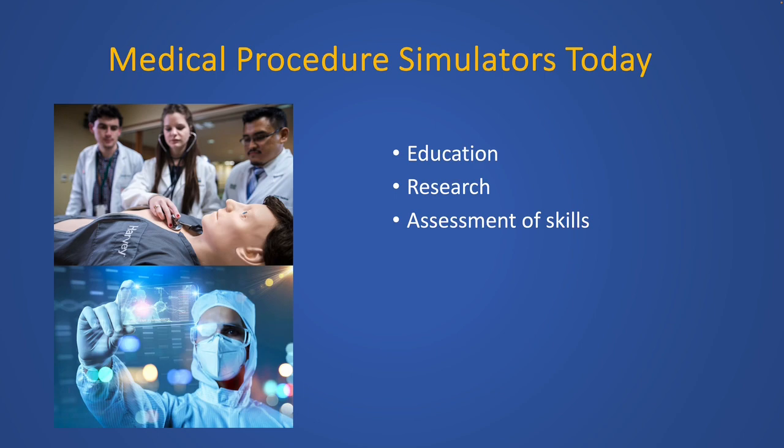Now, how do we use medical procedure simulators today? Well, firstly, we use it for education. Medical procedure simulators are largely used in medical institutes of all kinds. From vocational programs to surgical fellowships, these simulators offer the means to train clinicians on a variety of procedures.